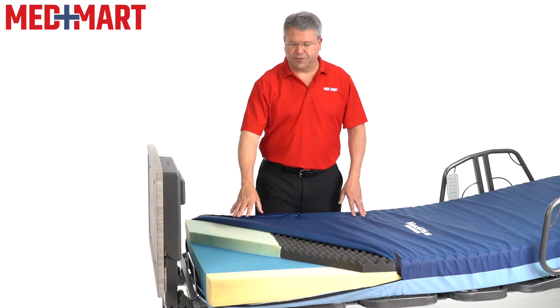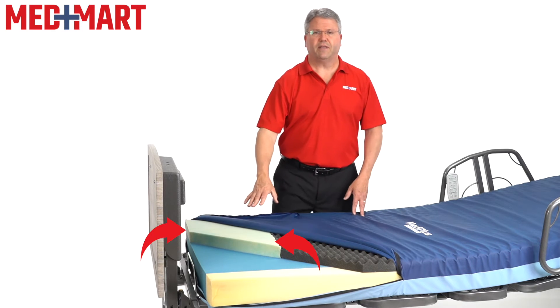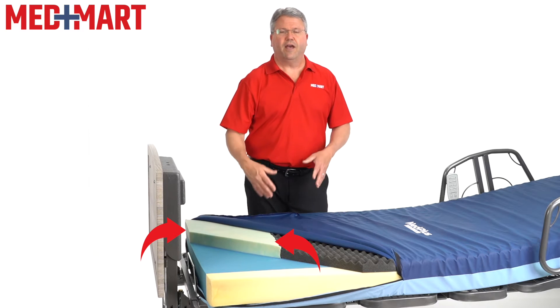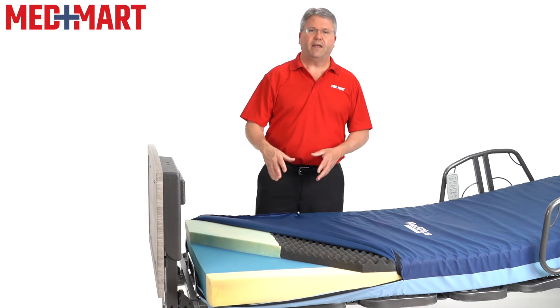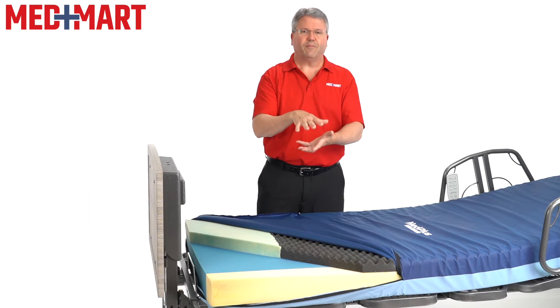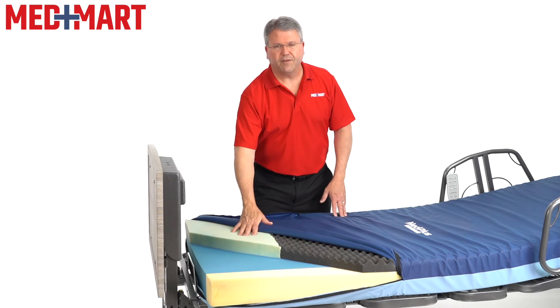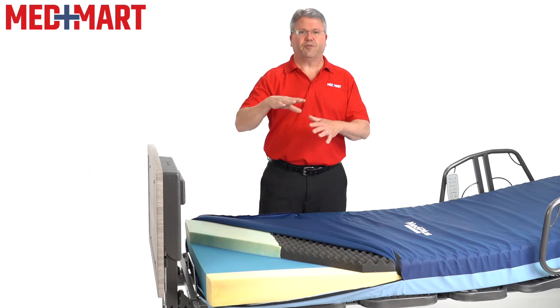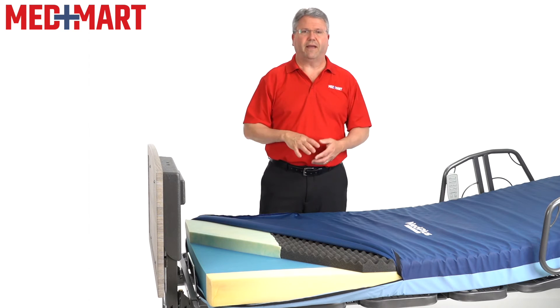The most important part of this mattress is the viscoelastic foam at the heel. This is what helps prevent injury to the foot. For most people lying in bed, the heel typically takes a lot of pressure, especially on a flat type of mattress. This special layer helps minimize the potential for injury and pressure sores to the bottom back of the heel.